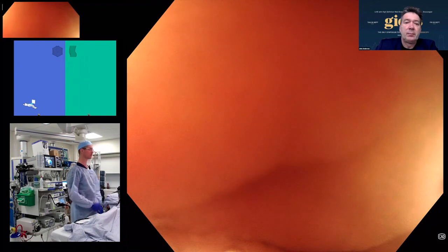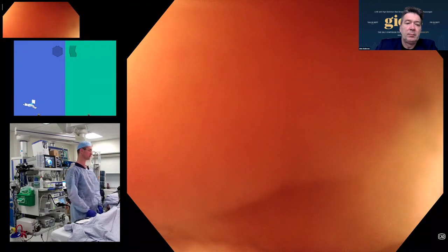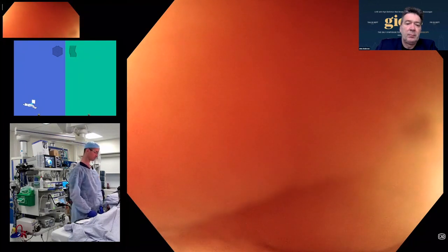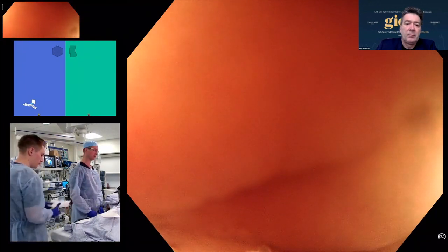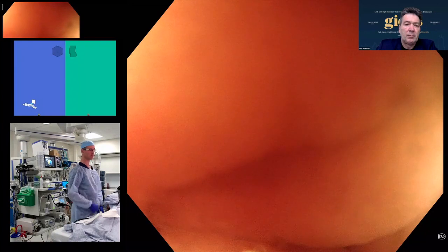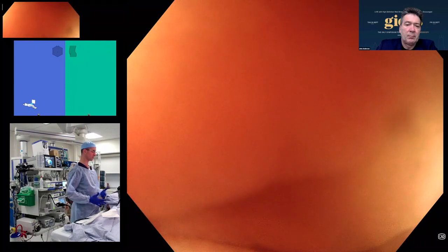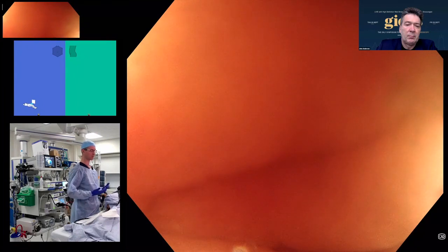Yeah, this patient actually is resembling the thing that I said a few minutes ago. So it's a patient with an abdominal surgery. So this patient had a prostate cancer and had a cystoprostatectomy with a Bricker ureostoma. So yeah, this is one thing. So with abdominal surgery, what specific measures can I do prior to the procedure, so by positioning the patient, or during the procedure.